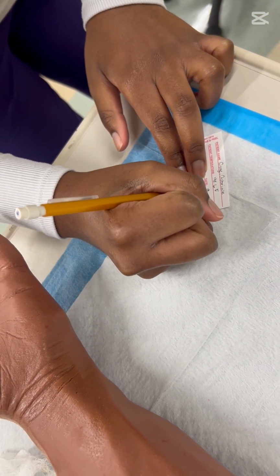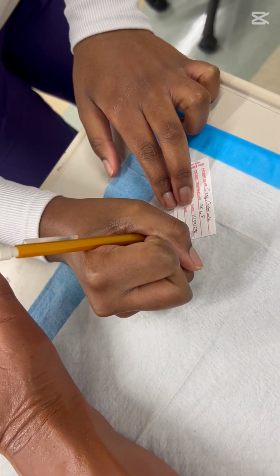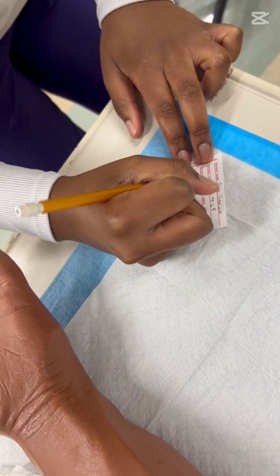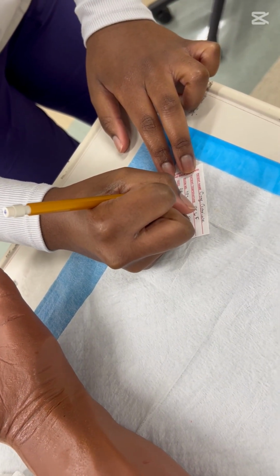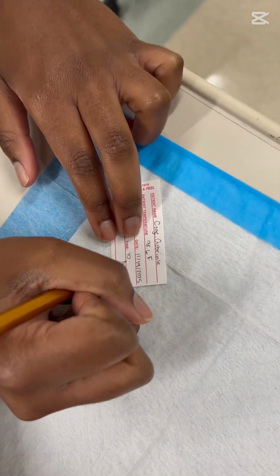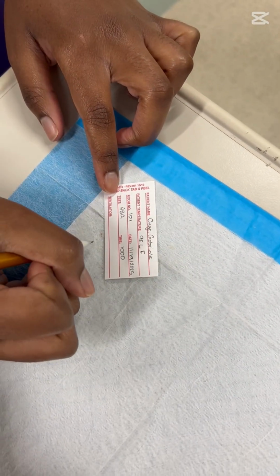Also, after that, you want to really focus on the importance of making sure the patient's full name, medical ID number, and date of birth are on the lab specimen, and that the nurse labels the date, time, and signature to prevent any delaying of care errors. Next, place the ABG draw over ice and contact transport to deliver the specimen to the lab.